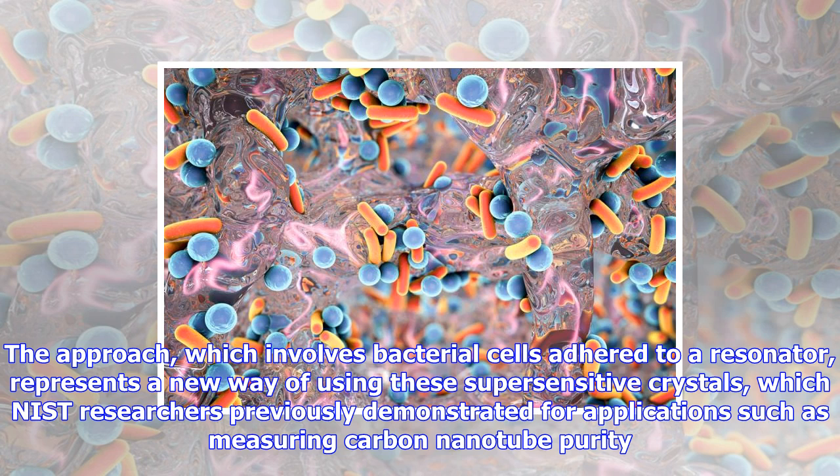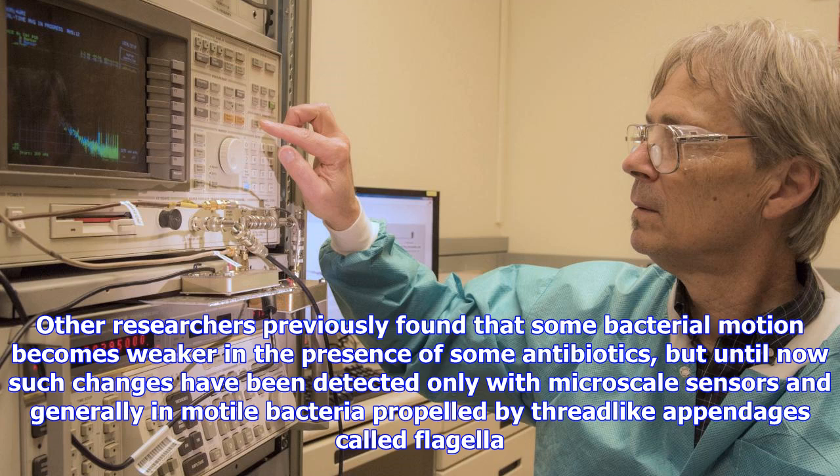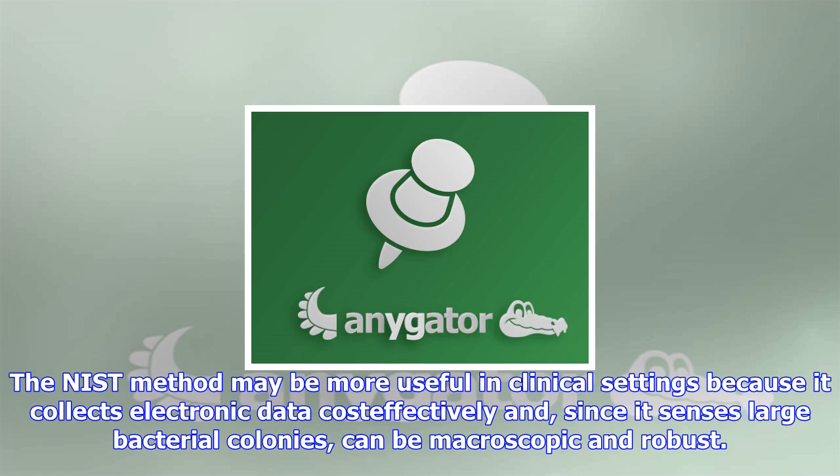The sensor is piezoelectric, which means its dimensions change when exposed to an electric field. A thin piezoelectric quartz disc is sandwiched between two electrodes. An alternating voltage at a stable frequency near the crystal's resonant frequency is applied to one electrode to excite crystal vibrations. From another electrode on the opposite side of the crystal, researchers record oscillating voltages of the crystal response, a signal that shows fluctuations in the resonant frequency, or frequency noise, arising from microbial mechanical activity coupled to the crystal surface.